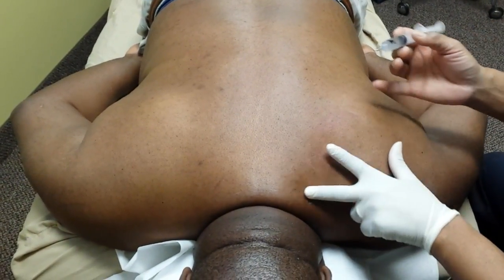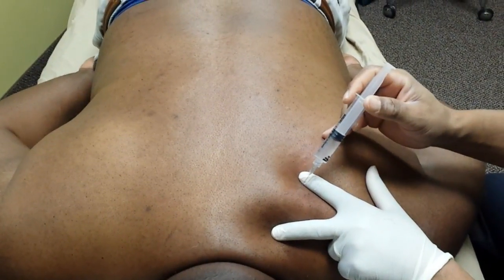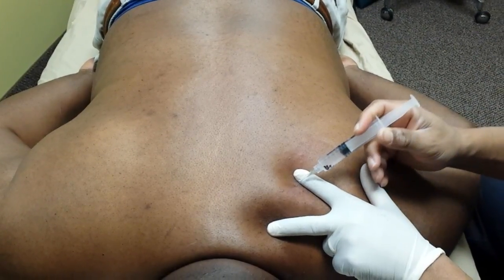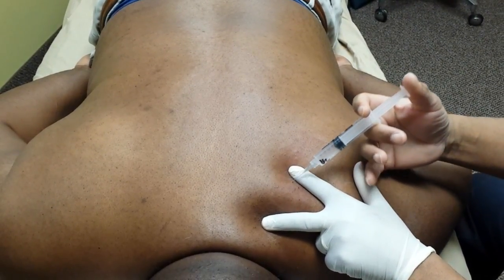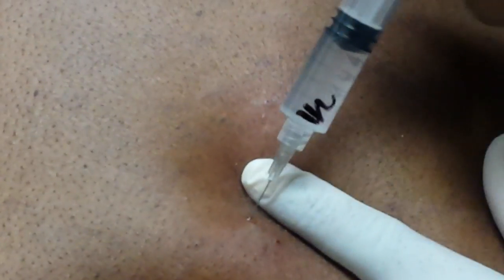This is a guy who's been having some neck and shoulder problems for the past few months and he came in for treatment. I'm bending needles on the muscles — let me show you what that looks like. This is a 27 gauge needle and I'm pushing pretty hard. It's almost like a golf ball, maybe a big huge eraser.